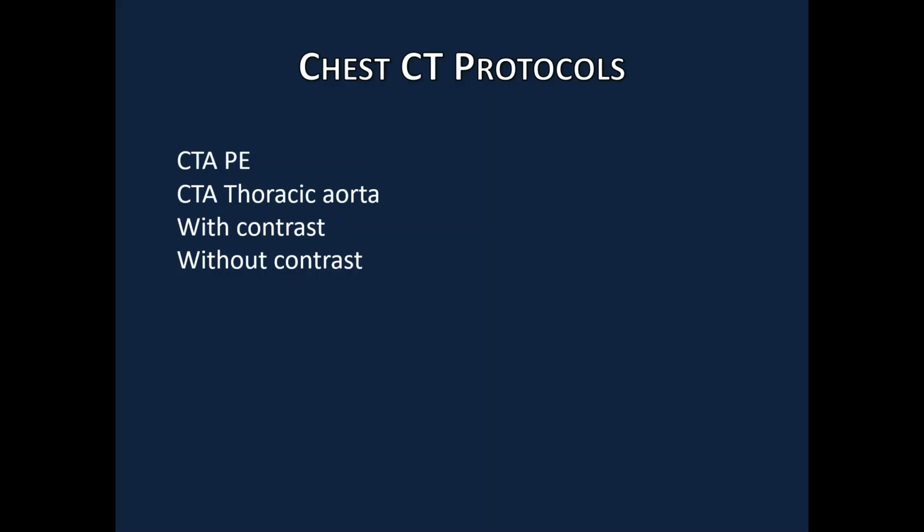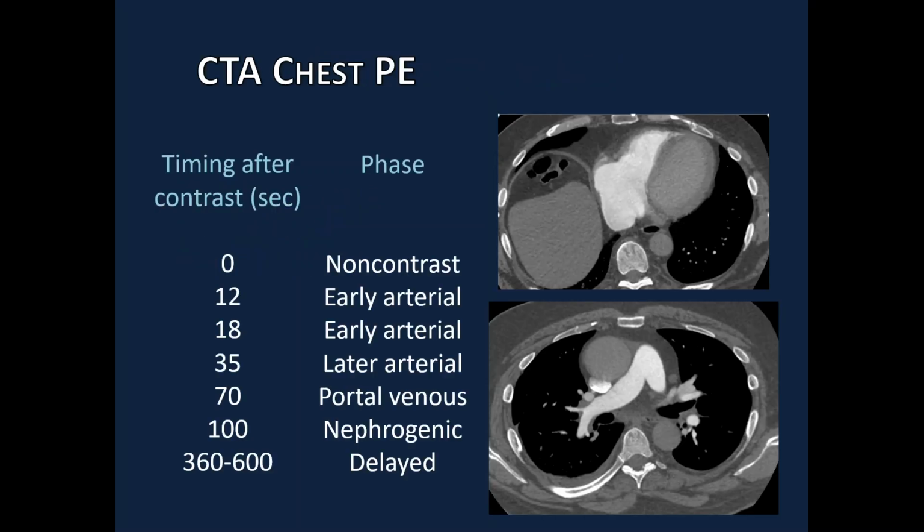There's several chest CT protocols. Today we're going to focus on four of the most common: CT angiogram of the chest pulmonary embolism protocol, CT angiogram of the thoracic aorta, CT chest with contrast, and chest without contrast.